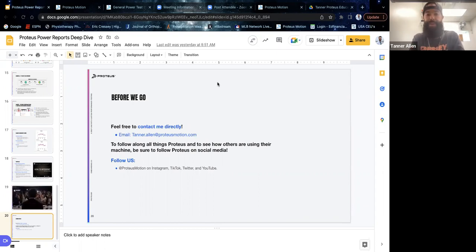I can only speak to the baseball side more confidently, obviously, but those 7% ranges with some of your throwers, you might actually see that to an opposite side than you would expect. So a quick example of this would be if you have a right-handed thrower and you test them on Proteus, what you'll typically see is that they're going to have higher power production into right rotation.